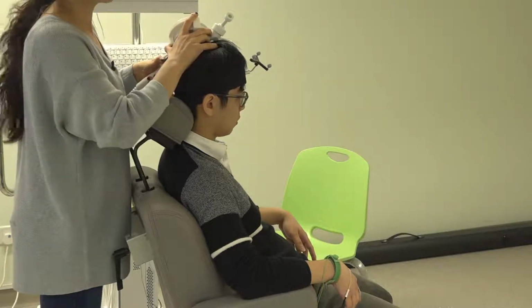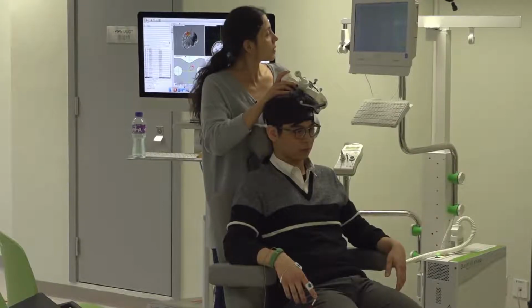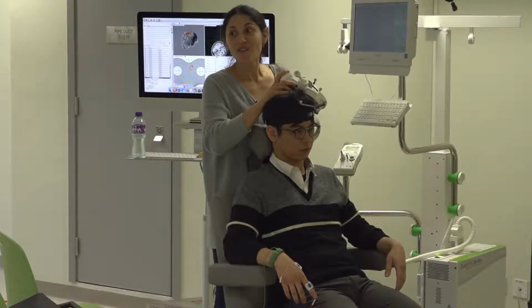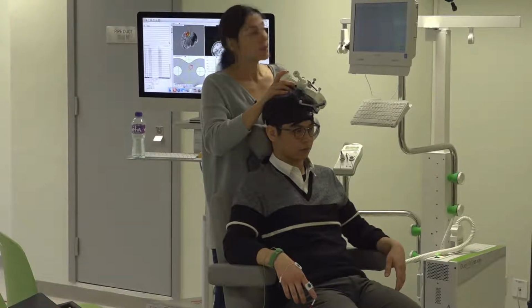Okay, good. You see, that's so effective. That is really effective. Okay. So it never fails for me when I measure it in that way. I know there it will be around the motor cortex.